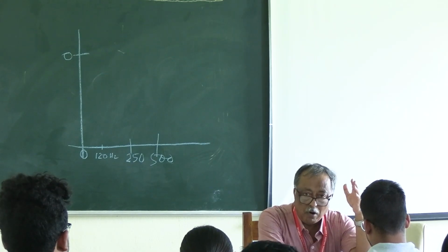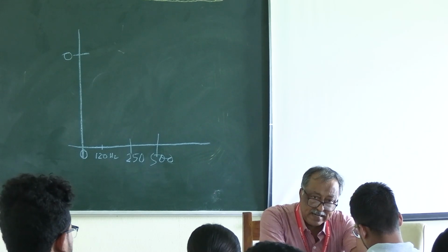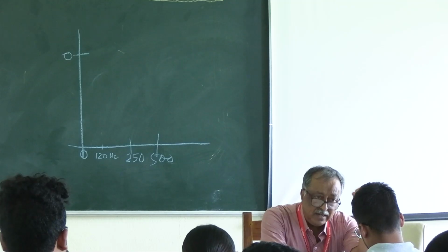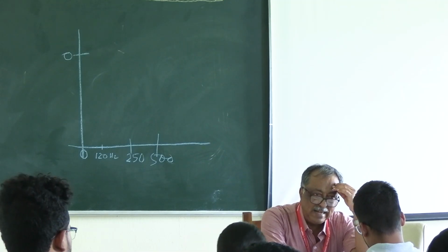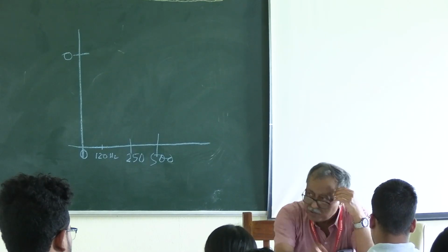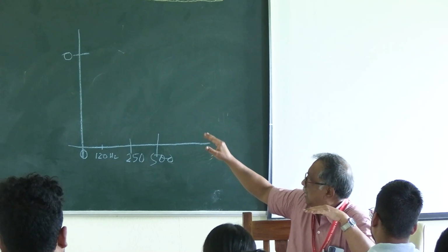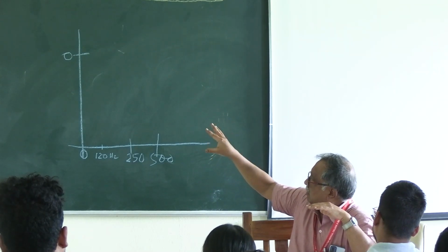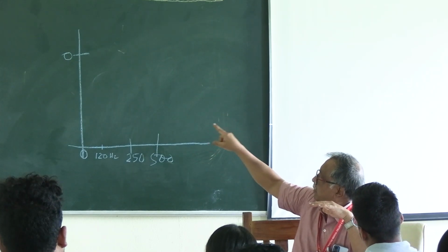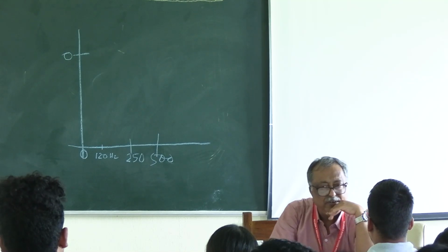That means in a group of healthy young adults, the minimum intensity required to make it audible, that is the audiometric 0. It is the mean value, and it is taken as the audiometric 0.